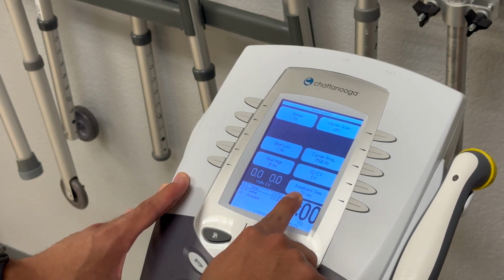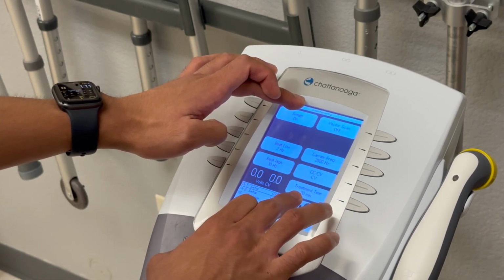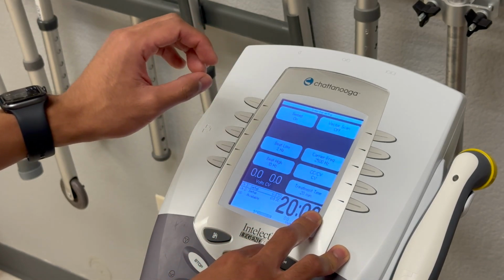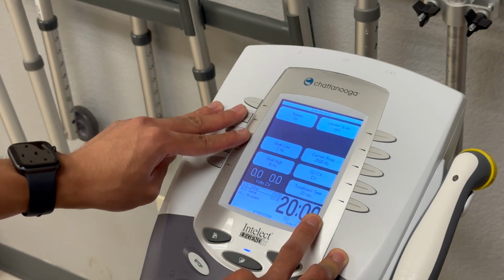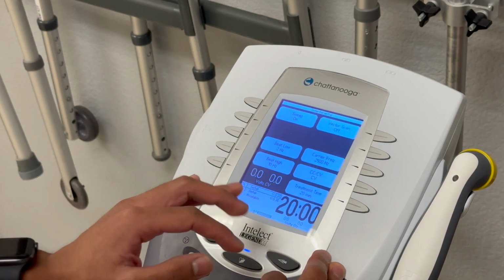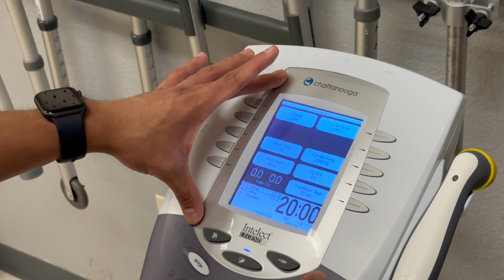Treatment time for interferential, we can go between anything between 20 to 30 minutes of treatment time, depending if we're on opiate release, gate control theory, or nerve block. All of them can be 20 to 30 minutes. And that is the setup of the interferential.